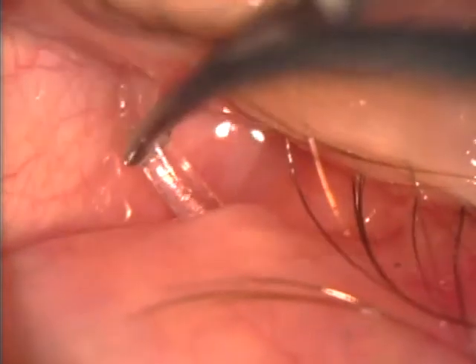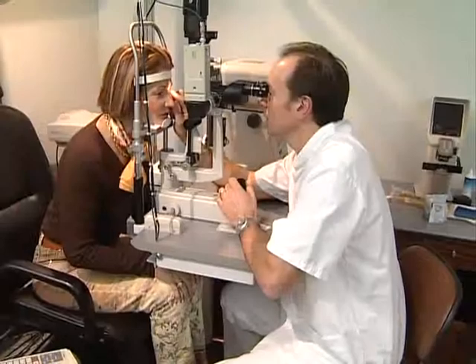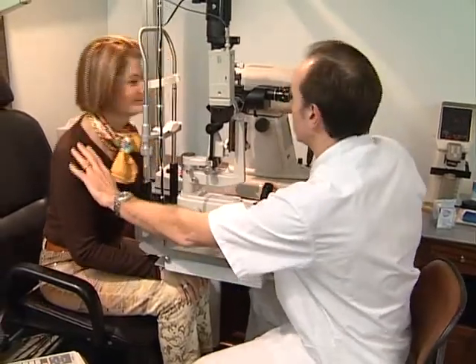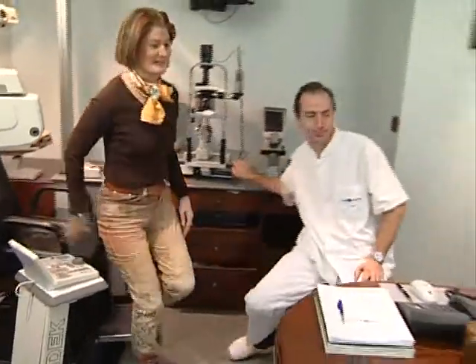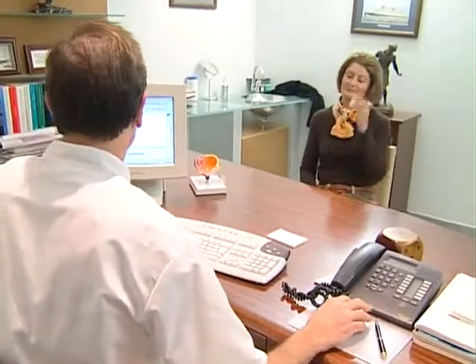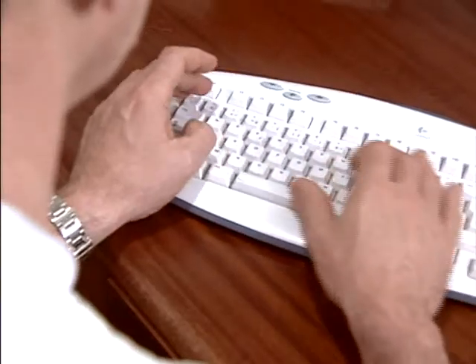It is very important that post-fitting recommendations are followed. Prescribe a steroidal antibiotic for 1 week, followed by a simple disinfectant that is used until the removal of the intubation, normally between 1 and 3 months later. The patients are followed up after 1 week and then every month.